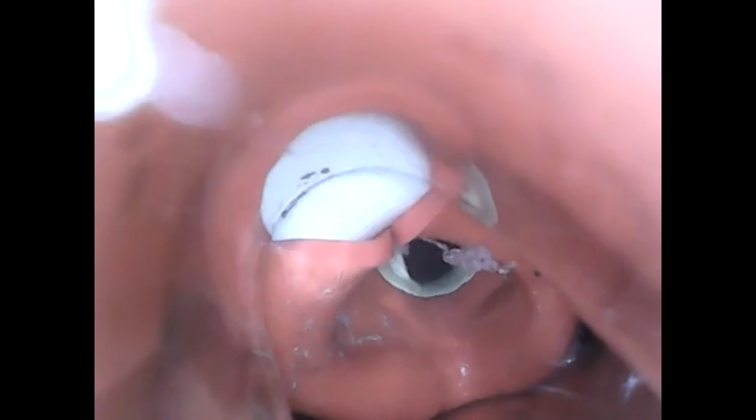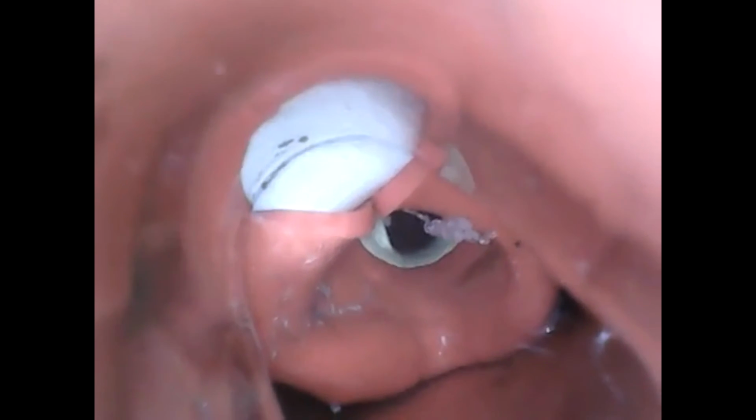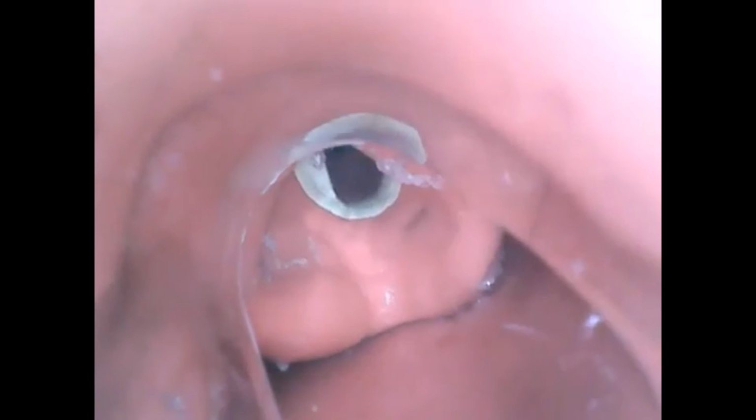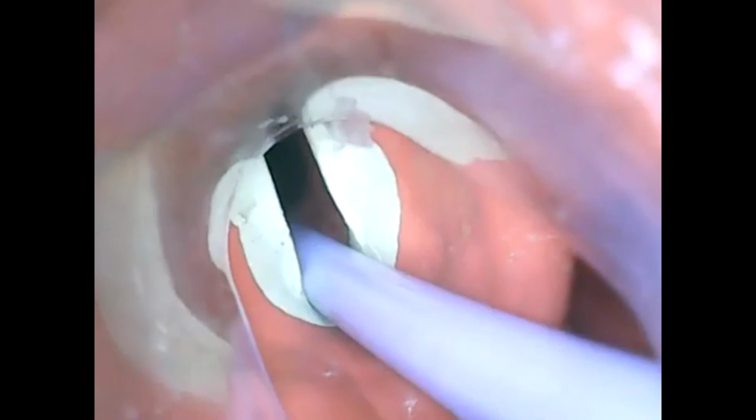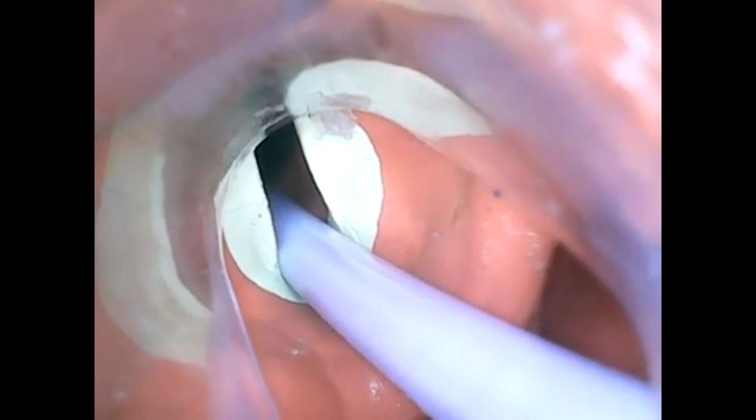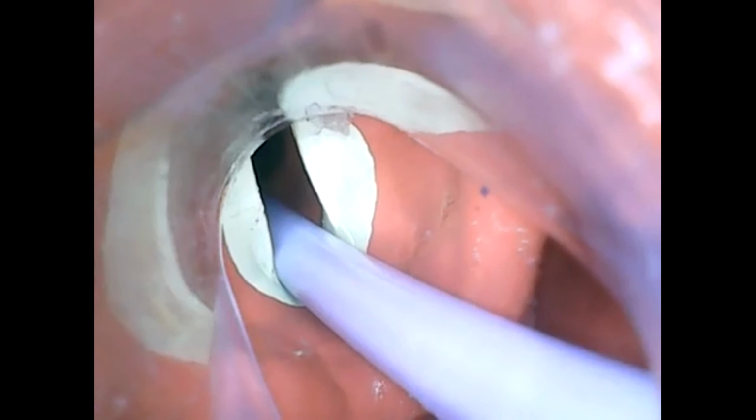Stuck a little camera down the V-scope to help us with this demonstration video. Pass that bougie through the cords. I'll hold the bougie in place. Now I'm going to reinsert the scope, confirming that the bougie is through the cords.